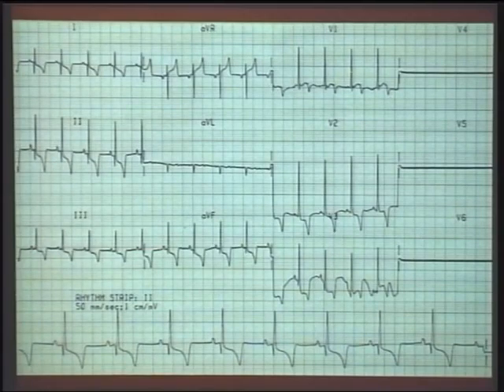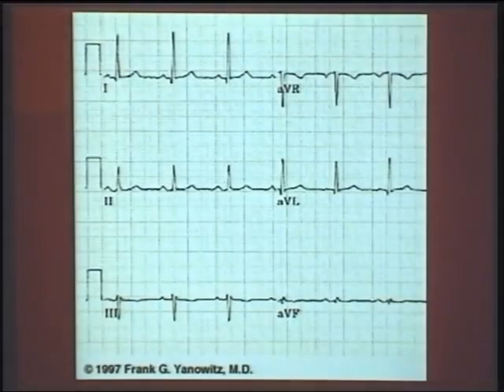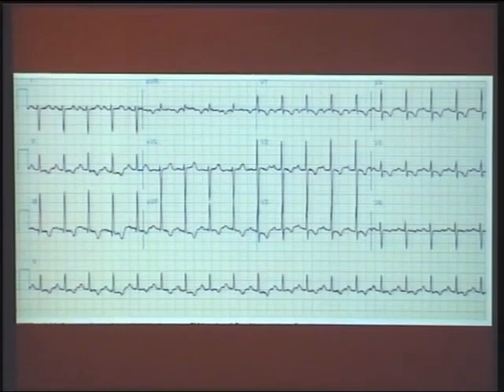Yes. What is the lead? Lead 2. Normal axis, degree. L1. What position? 0 degree. Horizontal, 0 degree. So look at AVR here, confirming AVR. Everything is negative here. Lead 3 again. Number. 120, right axis.